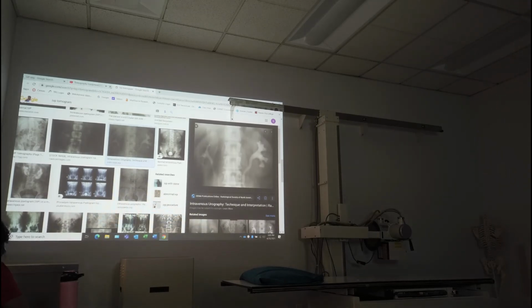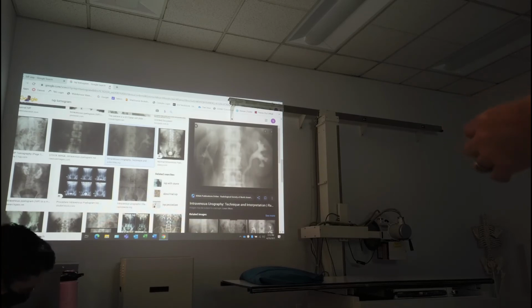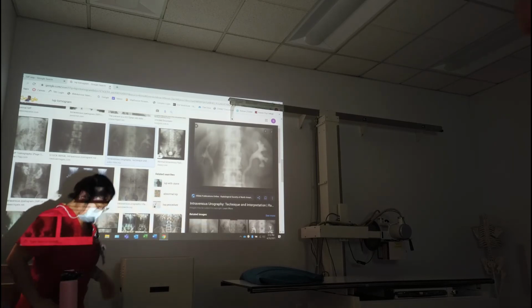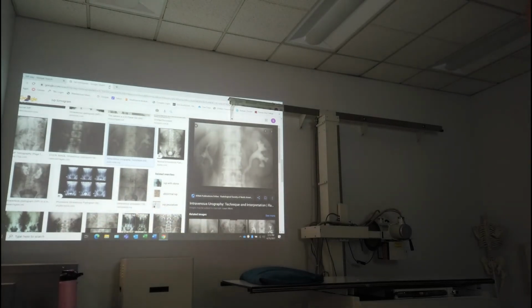So that just allows you to see a whole kidney at the border. What it's doing is giving you a thin slice of the kidney, like a section of the kidney. Imagine me holding the kidney like this, and imagine this area is 8 centimeters in here. We're just looking at this particular area of the kidney. It's blurring the top of the kidney and the bottom. Everything that's not within that 8 centimeter spot is getting blurred out.